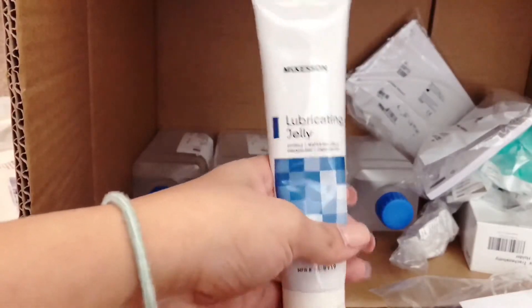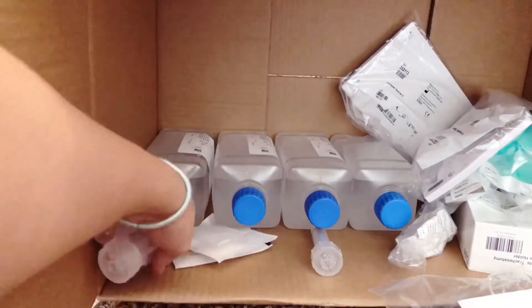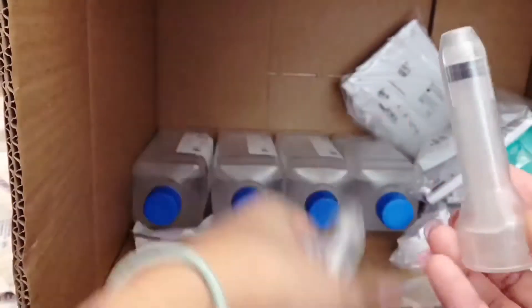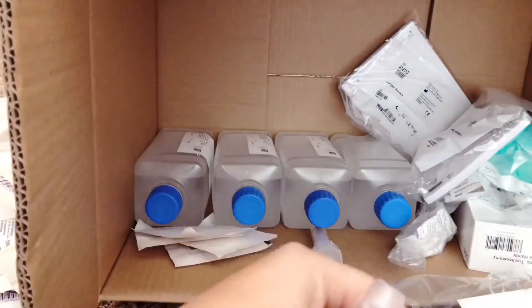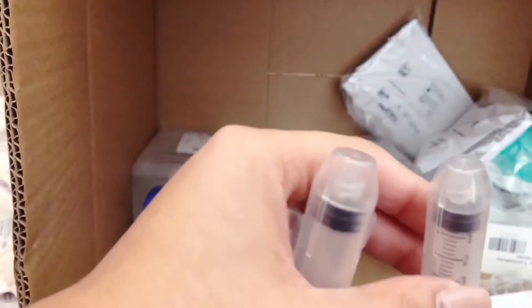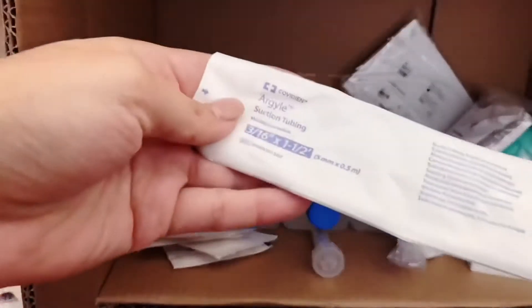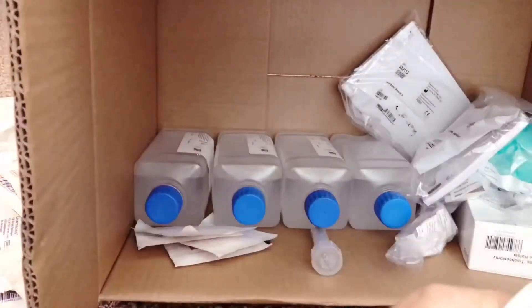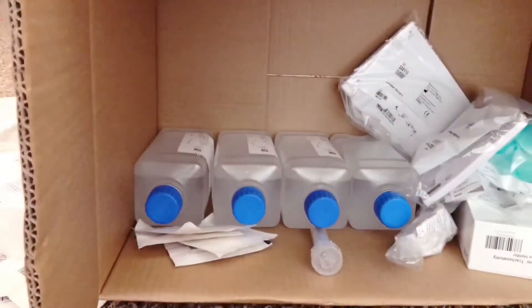We get four sets of tubing for her ventilator. We also get lubricant jelly — this is for whenever we do trach change because you can't just push the trach in, this makes it a lot easier and safer. I prefer the little individual packs. Then we got luer lock syringes — the tip is different from a regular syringe. This goes around the cuff of Olivia's cuffed trach to add or remove two cc's of water before trach change, because you can't just pull it out when it's inflated.